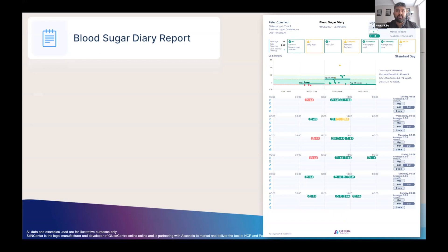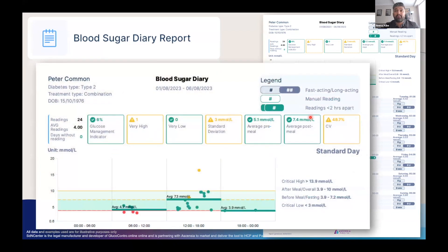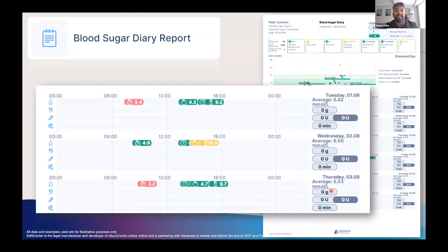The blood sugar diary report has been a very popular report due to the layout being very similar to a record diary. Without even looking in finer detail, it is simple to see with the colour-coded values where the low, high and in-range readings fall, the frequency of testing, and when in the day they are performed. The upper part of the report includes the same KPIs as the blood glucose dashboard report and the day view with all data points plotted by time. The main part is the diary layout with days of the week running down the right-hand side, with readings and meal markers positioned on the timeline.